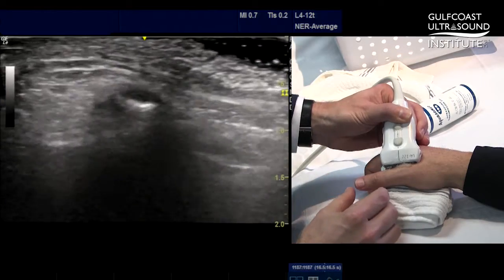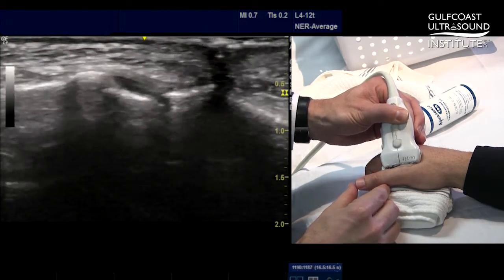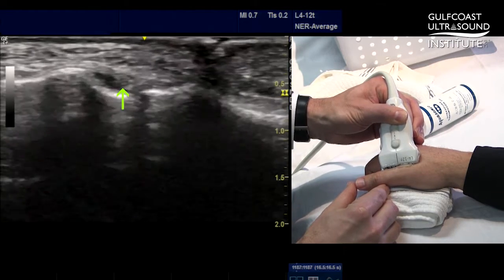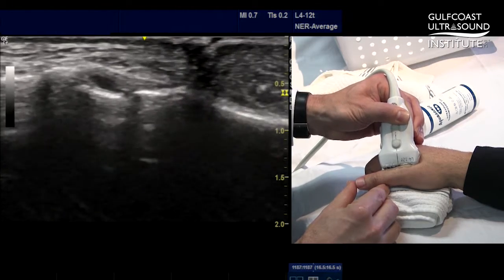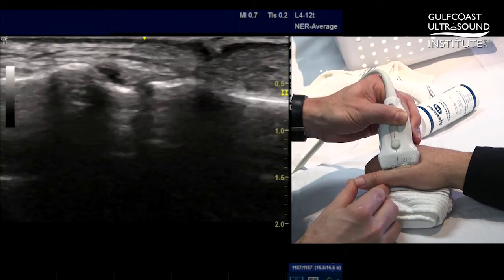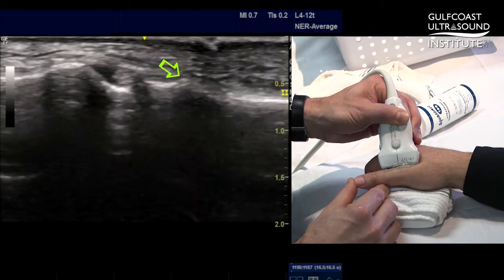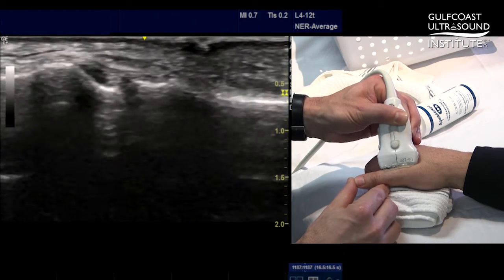If we look at the ultrasound image, another key point is to identify the characteristic bone contours. You'll see a concavity at the first metacarpal and a smaller concavity at the proximal phalanx. Identifying these two bone landmarks ensures that you are in the proper imaging plane. Note the normal appearance of the ulnar collateral ligament — a hyperechoic and fibrillar structure connecting those two bone landmarks.